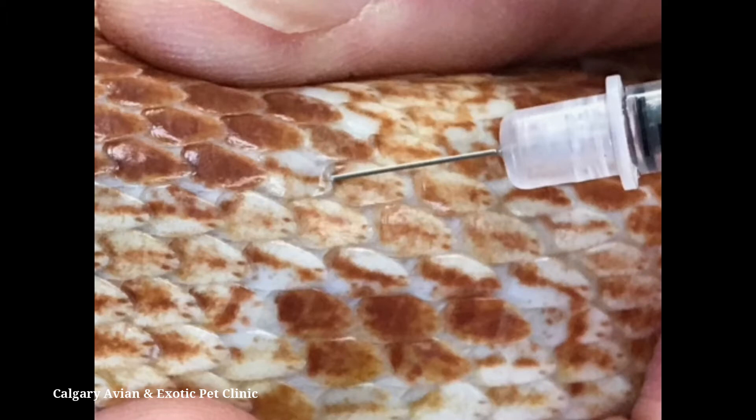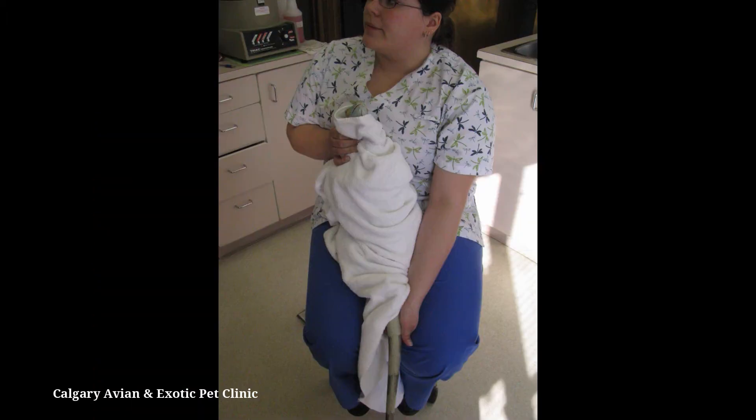Injections should be made between the scales as opposed to through the scales. If necessary, use an appropriately sized towel to wrap the body. Treat larger or more aggressive species with caution. You may need the assistance of a helper to ensure that the lizard is under control to prevent painful bites and scratches.